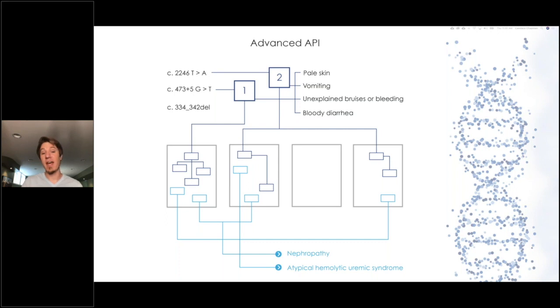But that's just step 1, actually, because from that set of cited articles, those highly prioritized articles, you can then see what other entity types were cited in those articles. For example, in this graphic, we're asking, from the articles that mention these combinations of variants and phenotypes, what diseases did the articles talk about? We can just as easily ask what therapies the articles talked about, or what other phenotypes, or any of those entities.